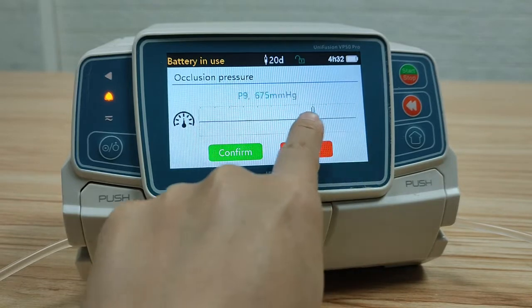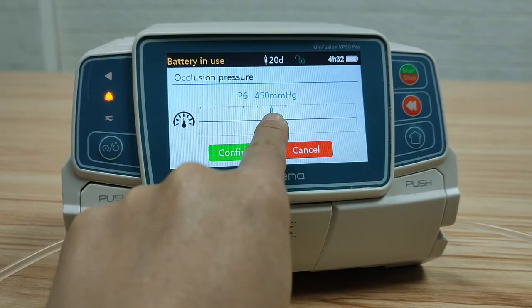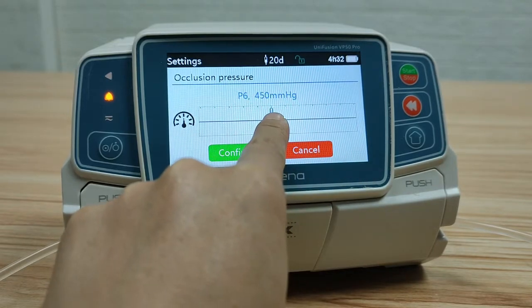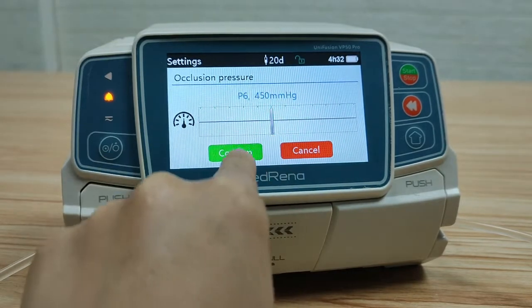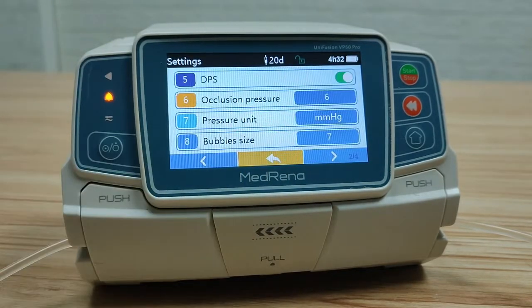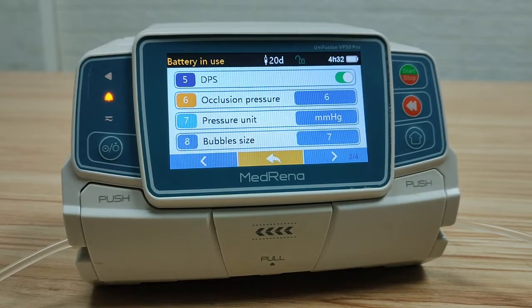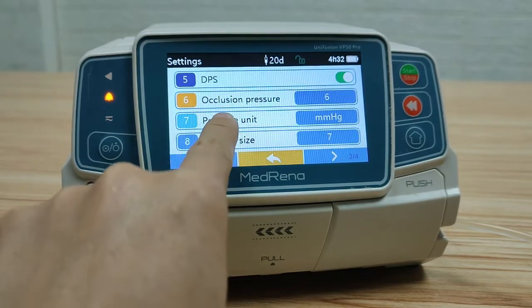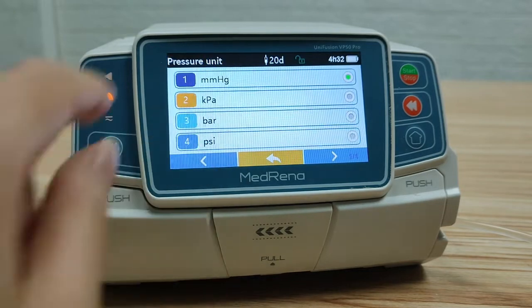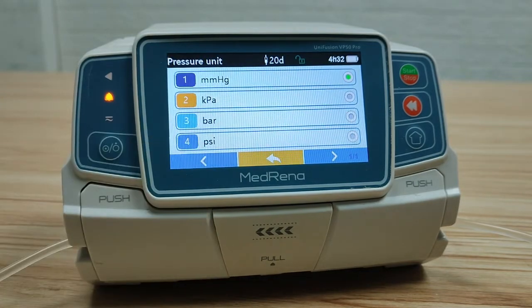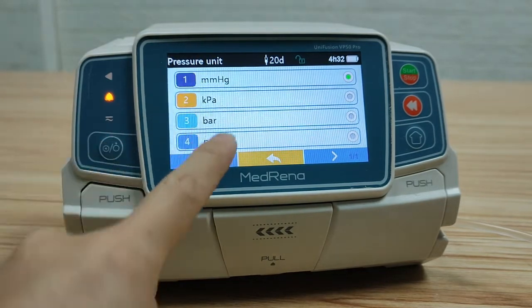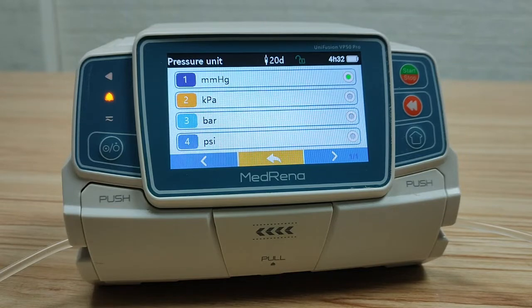We can select which level to trigger the alarm. Besides the preset levels, occlusion pressure levels can also be customized. For pressure units, there are four different pressure units available for choosing.